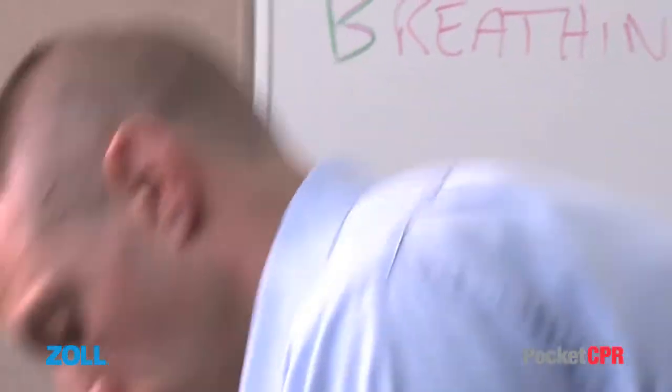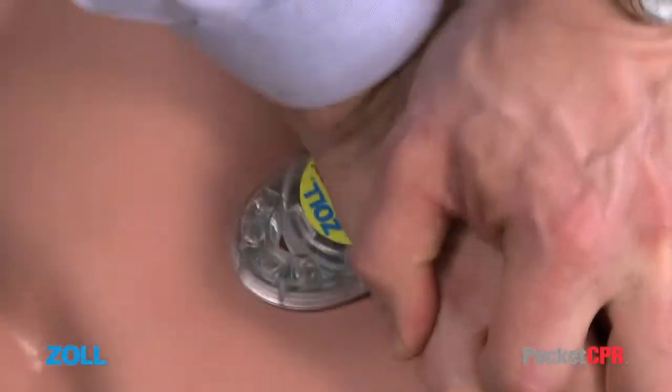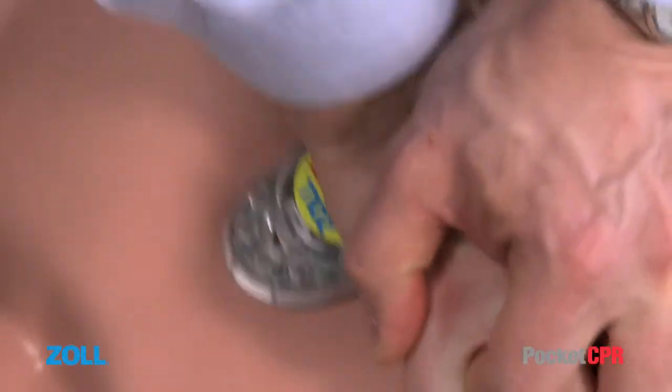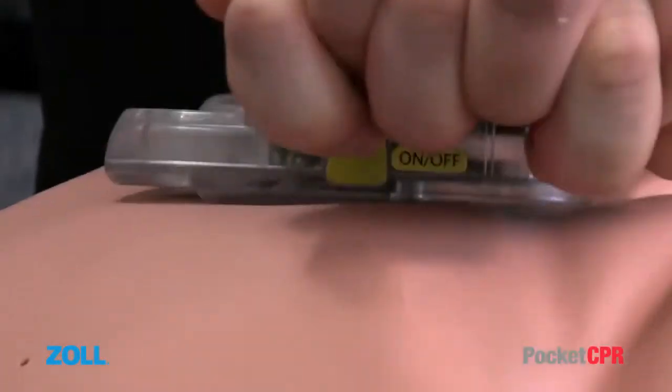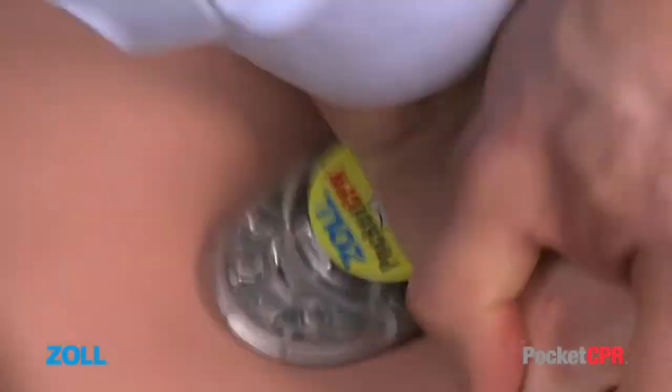But compressions also need to be deep enough. If your compressions are not the right depth, only one light at the end of the device will flash, and you'll hear it say, Push harder. When you're at the right depth, all 4 lights will flash, and the device will announce, Good compressions.